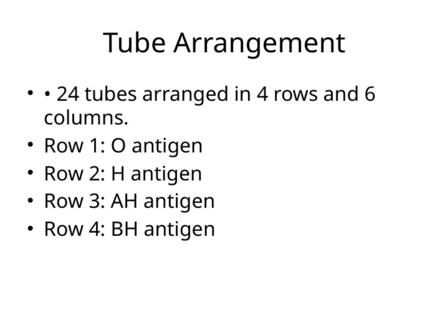This setup allows us to perform multiple tests simultaneously, making it easier to determine the specific serotype of the bacteria we're studying. By understanding this arrangement, we can see how serotyping becomes more efficient and accurate, which is fundamental in microbiology and infectious disease diagnosis.